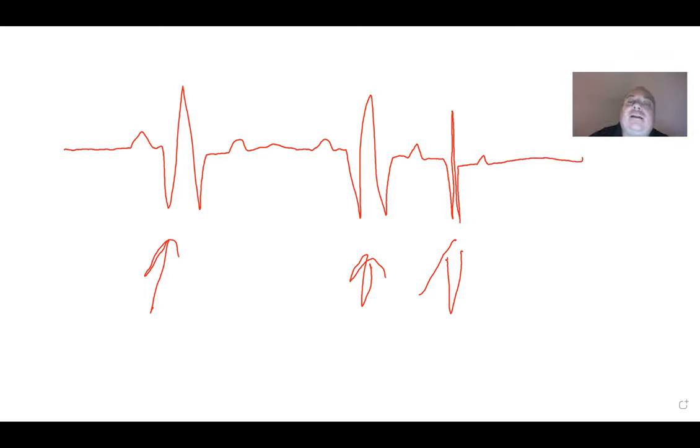So I'm going to look at it and say, well, do I have a P wave? Because if I have a P wave right here, that probably was a PAC then, right? Because it happened too quickly. But I don't have a P wave, and my T wave is not marginally bigger than any of the other T waves, we're going to say. So it's not a PAC because I don't have a P wave and I don't have a preceding T wave that's marginally bigger. So if it's narrow, and it has no P wave, we're going to call that a junctional beat, okay?